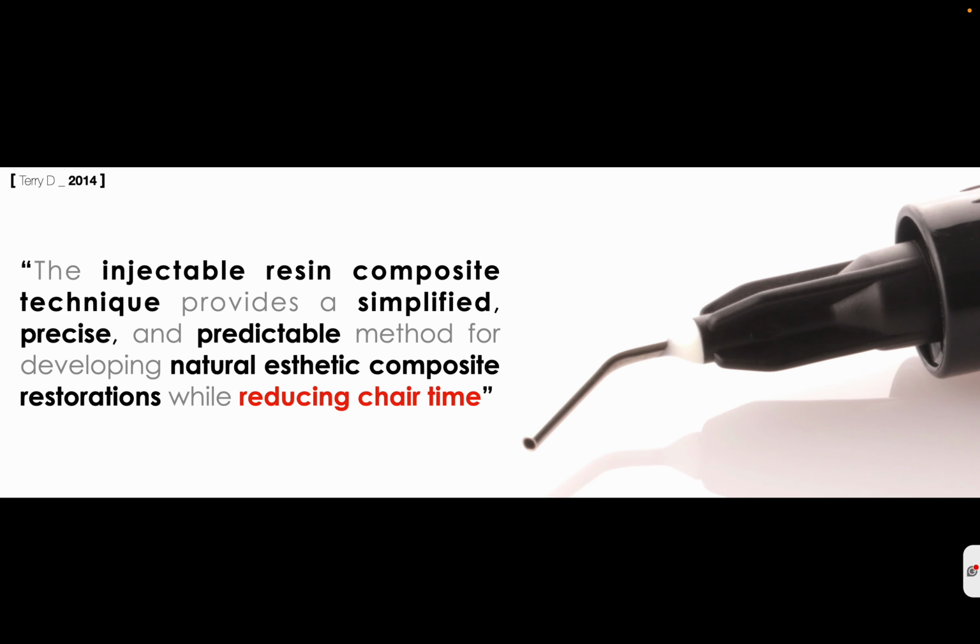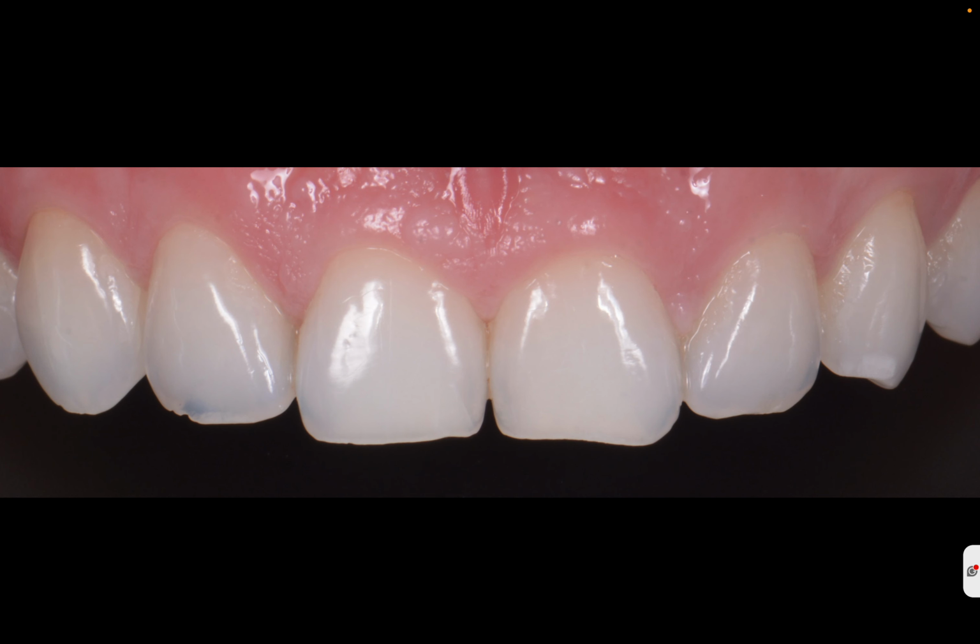So with these materials you can try to copy and paste the mock-up or the try-in that you chose for the patient. So it can be a precise, predictable and simplified method to reconstruct and recover the original shape of the patient, or a new one if demanded, while we reduce the chair time.